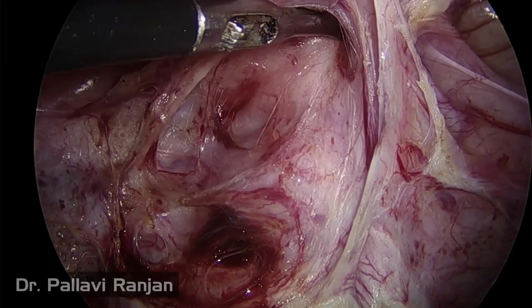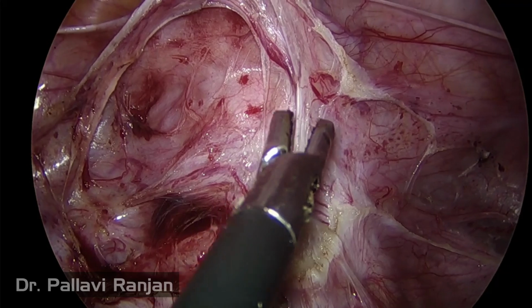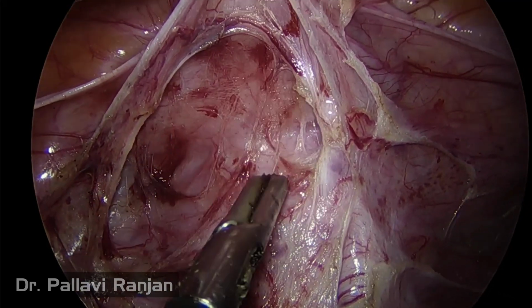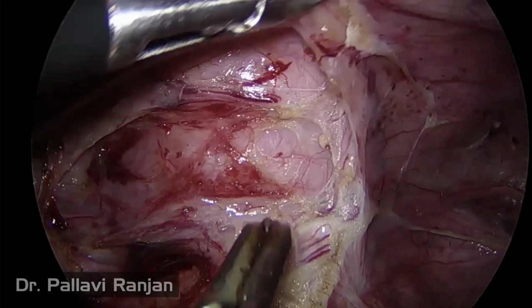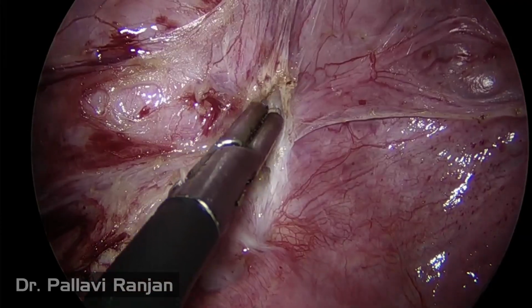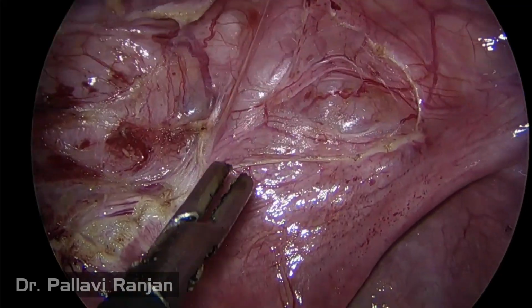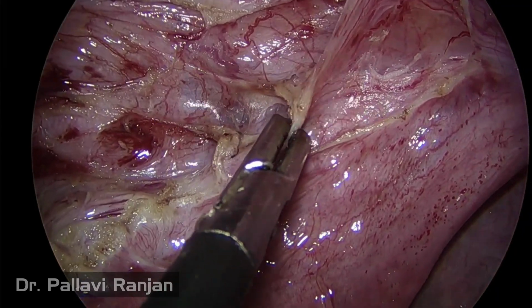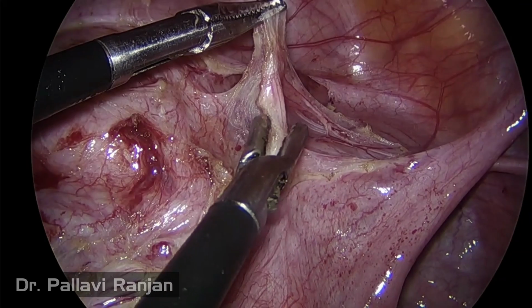Moreover, for beginners who are not so well versed with this technique of bladder separation, it helps in tissue identification and separation of the UV fold. So here we are proceeding with end to end bladder dissection so that we get an adequate segment over the lower uterine segment, so that even when we freshen the scar, we don't have to dissect the bladder at that time. So now you can see we have completed the bladder dissection completely.